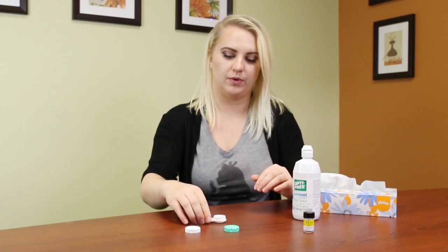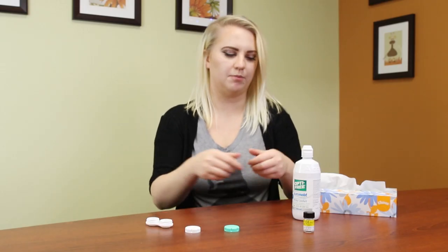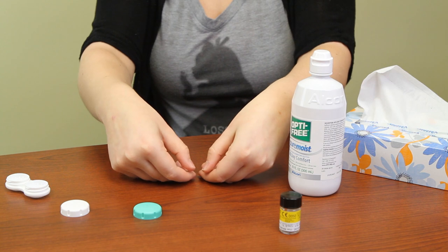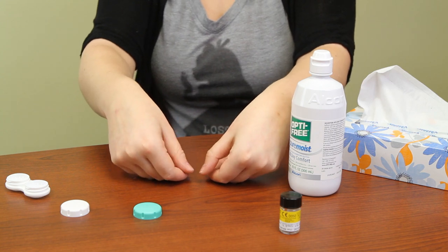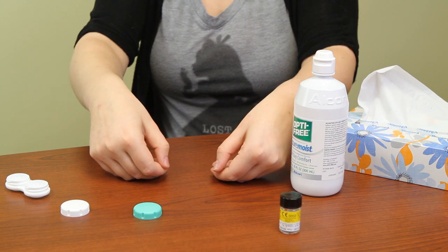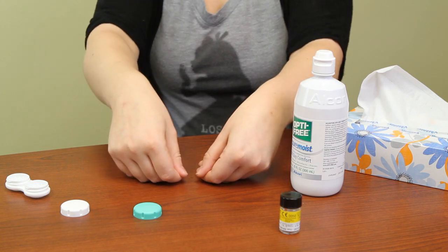When you are ready to remove the contact lens, take both of your thumbs. Again, make sure that your fingers and the child's eyelids are dry. Take your thumbs and get as close to the edges of the eyelid as you can, pull open so you can see the edges of the lens, then push down and in and it'll pop right out. After you take out the contact lens make sure that there are no rips or tears and that the contact lens isn't cloudy.